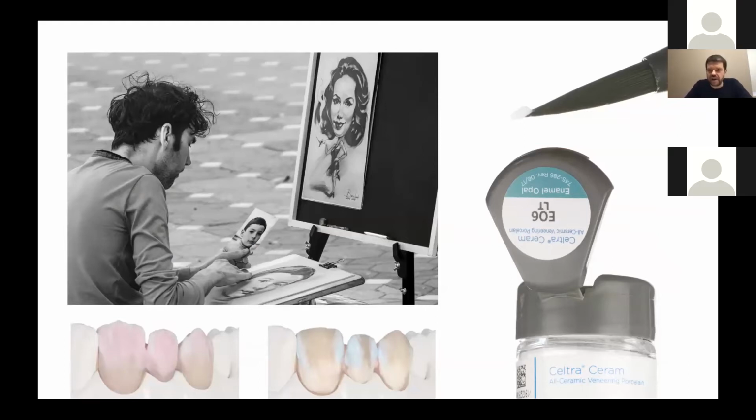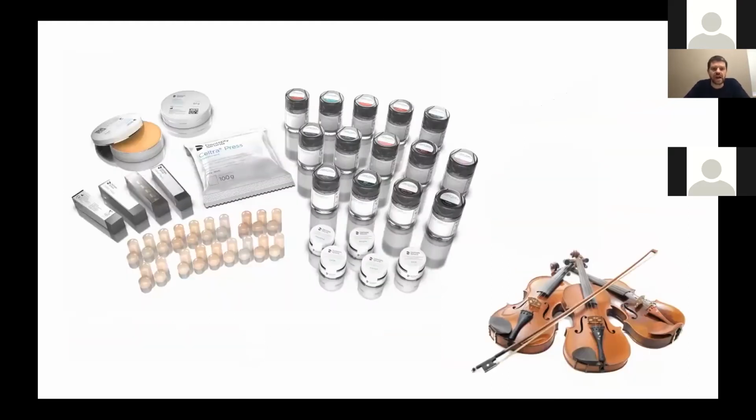And this is a very exciting work, because nowadays we have three very important instruments that are very useful and very effective to create the aesthetics of our restoration, and all of them are very important. This is the all-ceramic framework material. This is veneer porcelain for individualization of our restoration, and of course these are our stains that are especially developed to apply on our restoration.